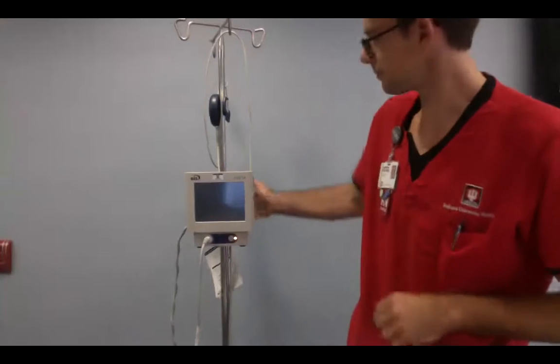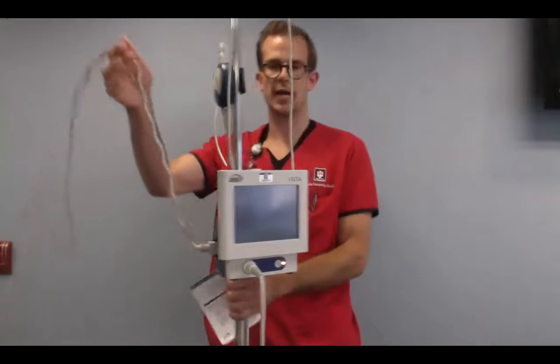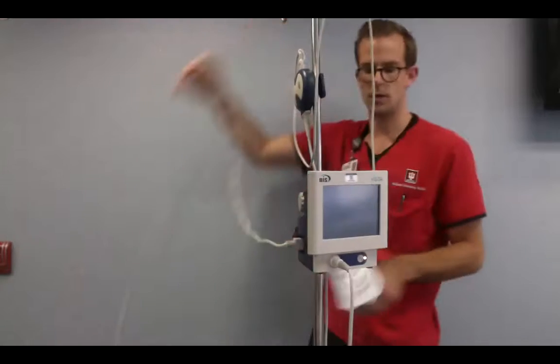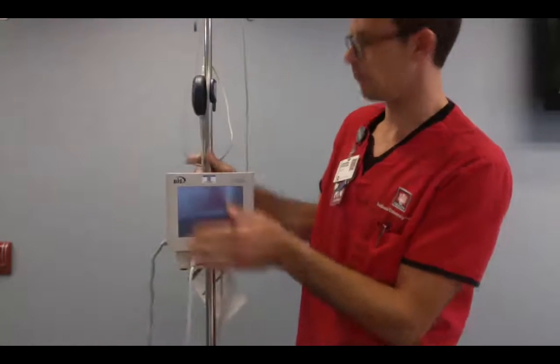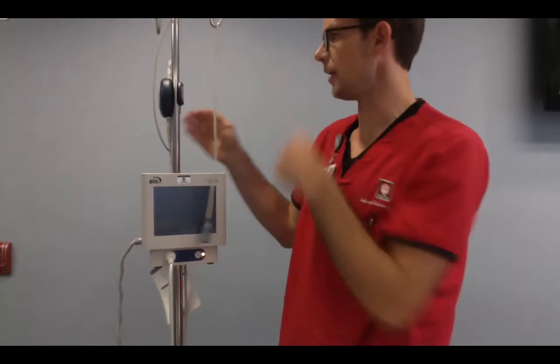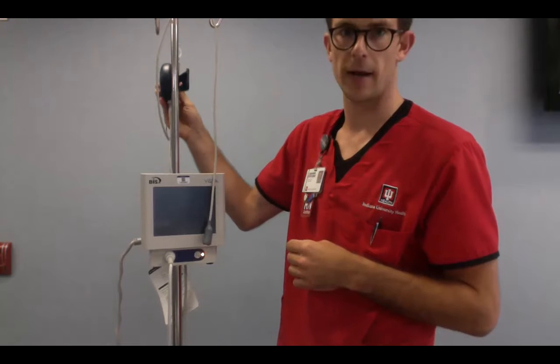So let's show you the BIS monitor in action. Here we have the BIS monitor. The back or the right side has a plug for it to plug into the wall. And in the front, we have the cord that would plug to the probe and go to the patient. This is a clip, so you can use this to clip to a bed rail, the headrest.